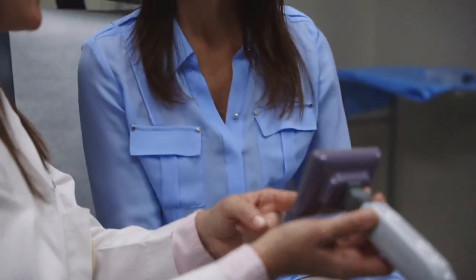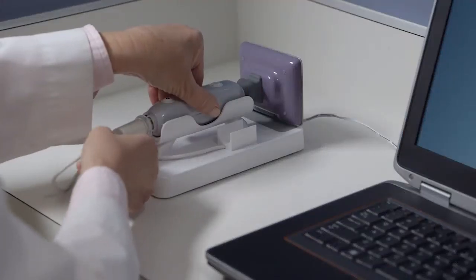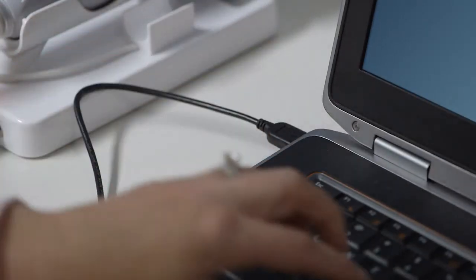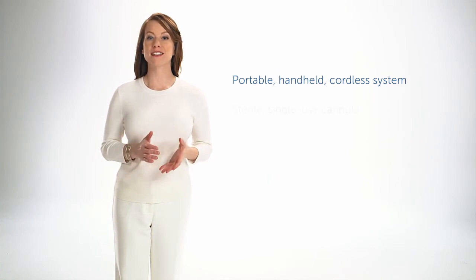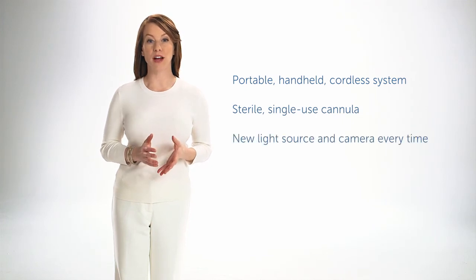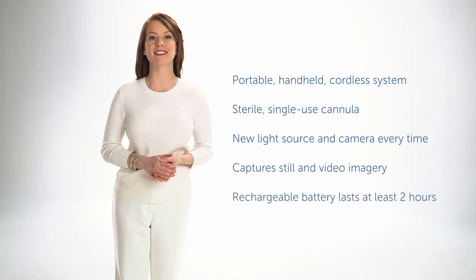After the procedure, you can easily play back photos or video from the EndoC handset to show your patients. To charge the battery, connect the handset to the dock, then the charging cable to the handset. It is recommended that the handset be placed on the dock for continuous charge when not in use. To download photo and video, connect the USB cable to a computer and turn the handset on. EndoC will show up as a device, just like a digital camera. The all-in-one EndoC system lets you perform in-office hysteroscopy in any room, at any site. The sterile, single-use cannula gives you a new light source and camera for every patient. EndoC captures both still and video imagery, and the rechargeable battery lasts at least two hours.